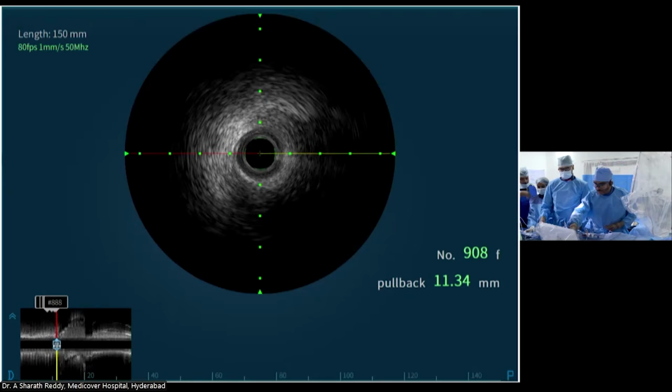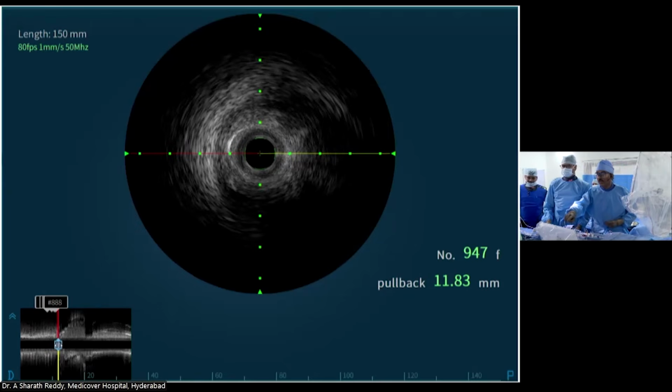So what I did, I thought of wiring with a microcatheter after removing IVUS. This is not live IVUS puncture, which I tried because even the branch is coming off the proximal cap in IVUS. I was not comfortable, and it was not great for IVUS guided cap puncture. So I thought of trying, just using my CT information. So I tried wiring the middle zone.